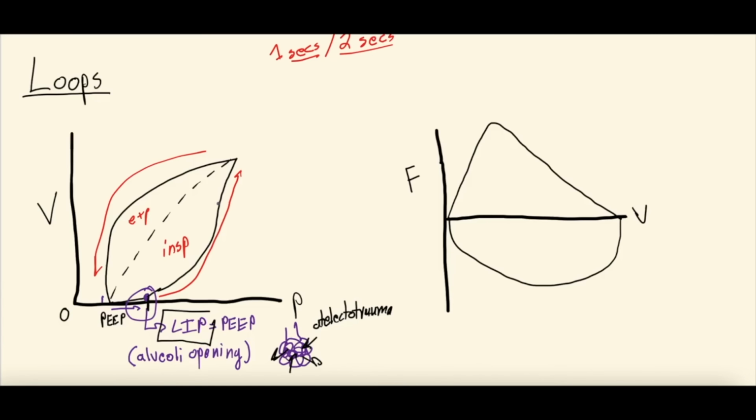Then there's an upper inflection point. The upper inflection point is where the curve of this waveform starts to change. We'll again make it more obvious, so excuse us, it's not going to connect, but that's okay. So the upper inflection point could look like this. It is where, again, the pressure starts to increase a lot and the volume does not increase. And this is known as the upper inflection point.